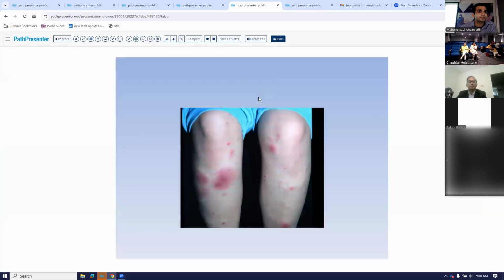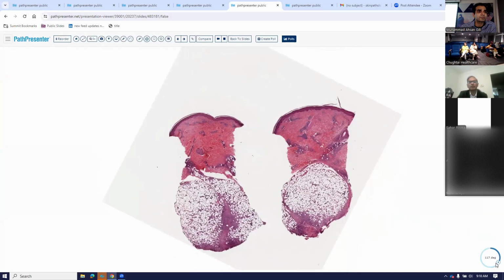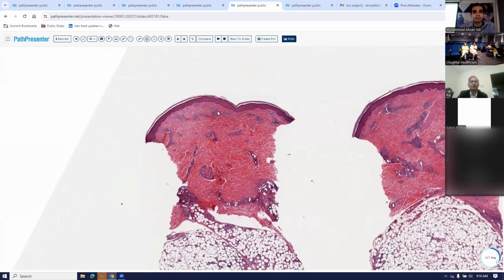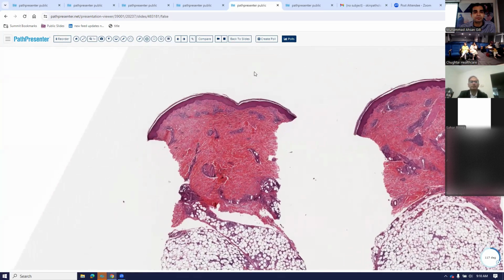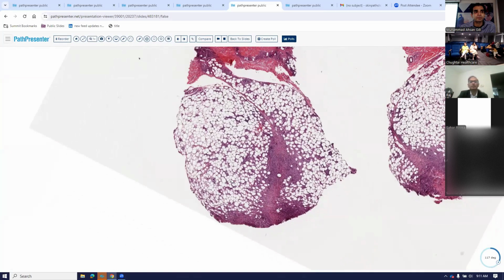And then I think this is the last pattern, where you see erythematous pinkish lesions bilaterally on both shins of the patient. And then this very classic inflammation that you see now within the subcutis. If you look again at this inflammation, the epidermis looks pretty normal. The dermis has a mild perivascular lymphocytic infiltrate, but the main action is happening in the subcutis now. So what is happening in the subcutis?